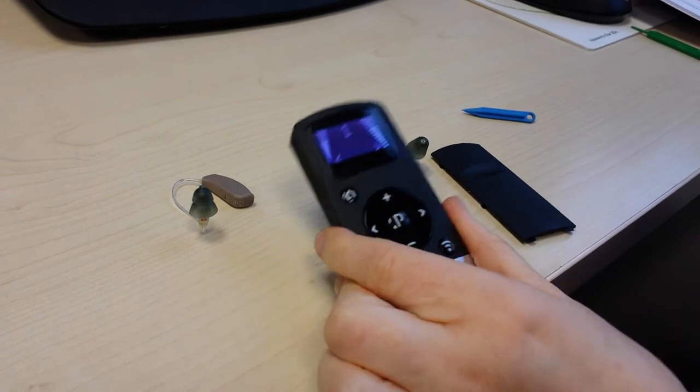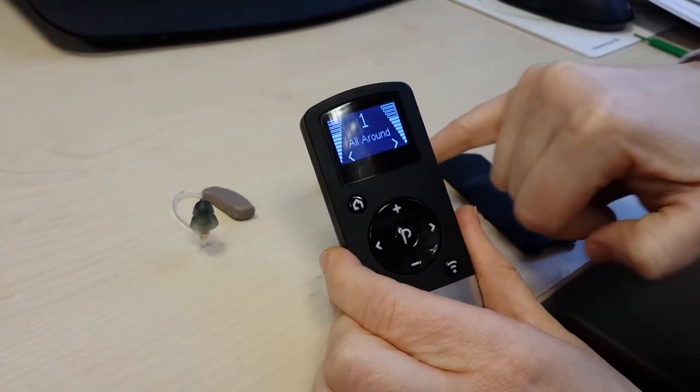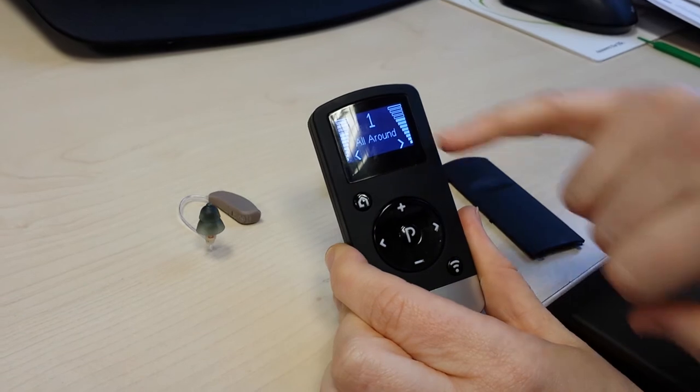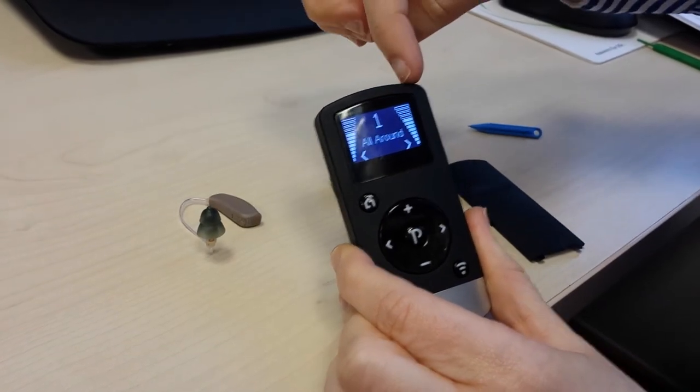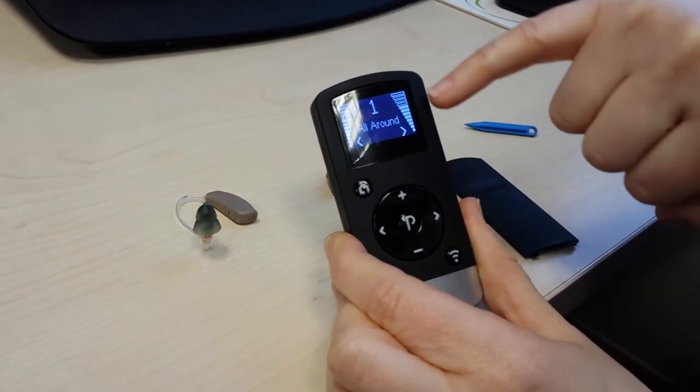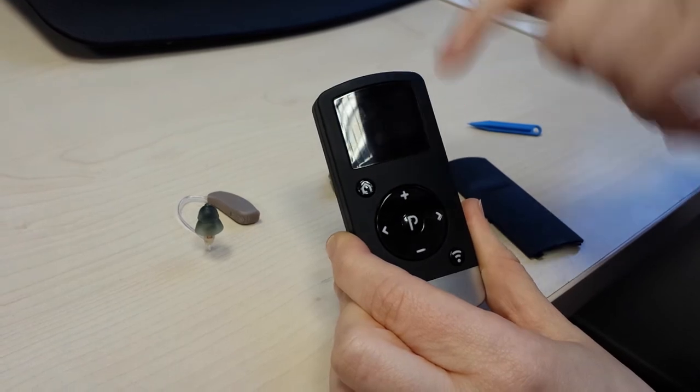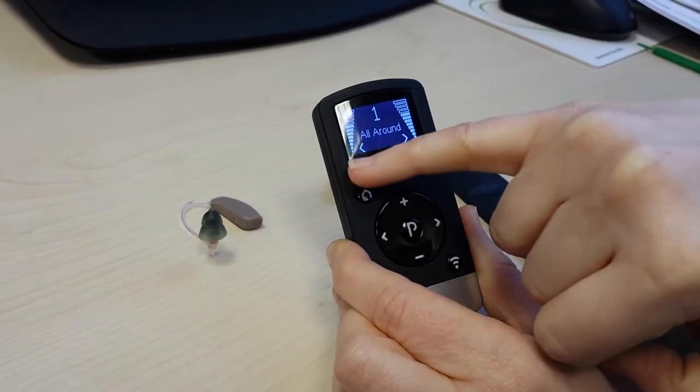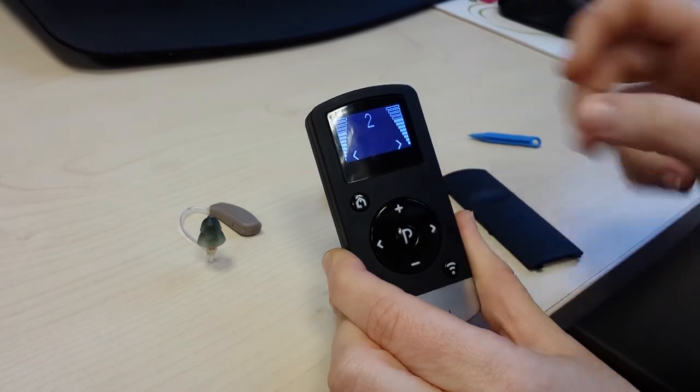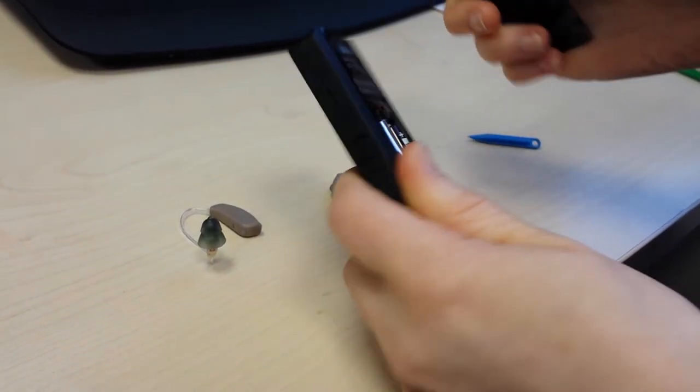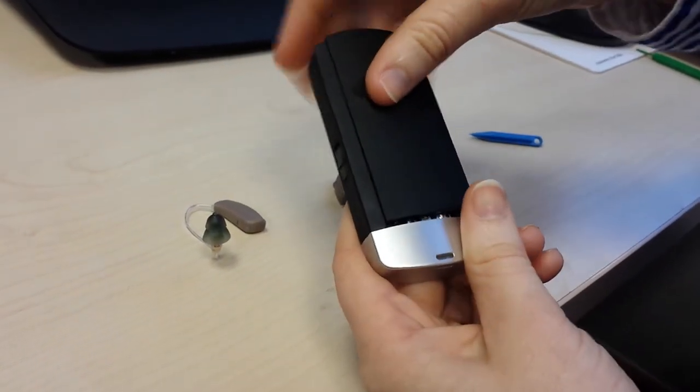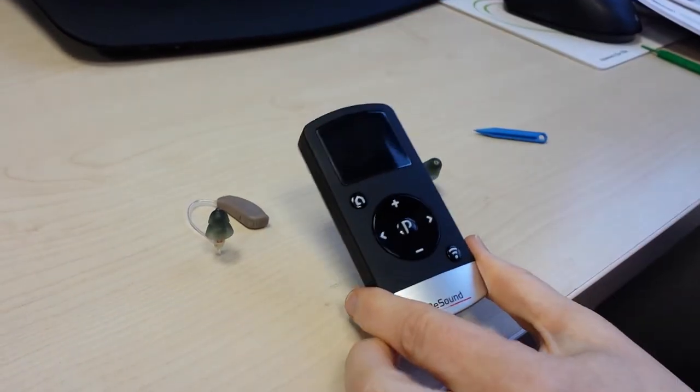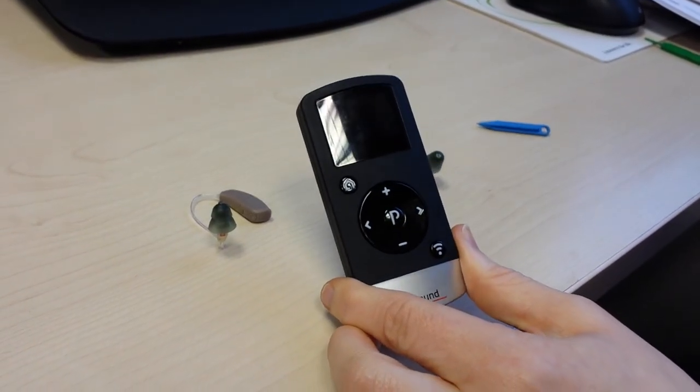The remote control will instantly pick up the hearing instruments and you will see that it is connected. The volume control will be shown on either side. Simply close the case back on and it is all completed.